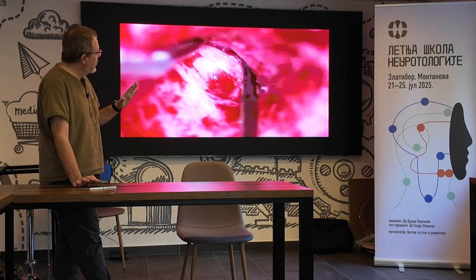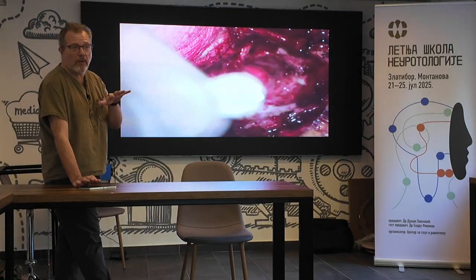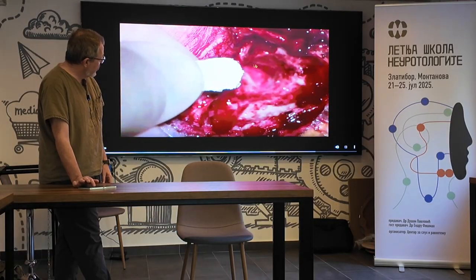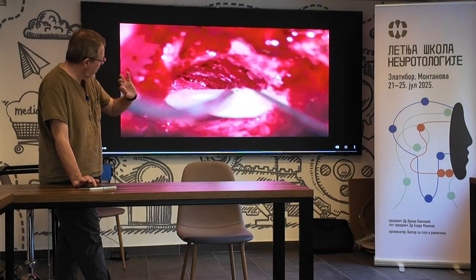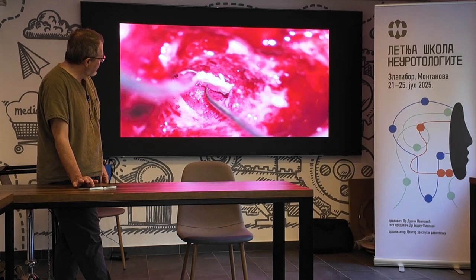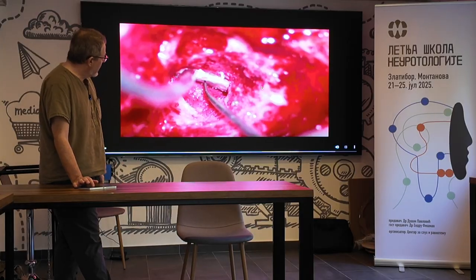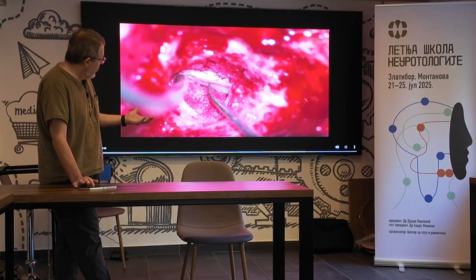You know, initially we just tried to resurface them to try to keep the lumen open, but most of those patients required a revision. So now we just gently compress it. And then here I've shaped the bone that I took off of the mastoid cortex, and I have a little plate. I made a little notch in it so I can move it, and I'll just slide this up over to resurface the floor of the middle cranial fossa so that the patient doesn't develop an encephalocele. Okay? And this type of patient can be done even as an ambulatory operation and go home same day.